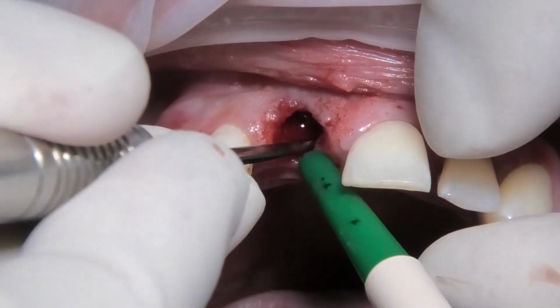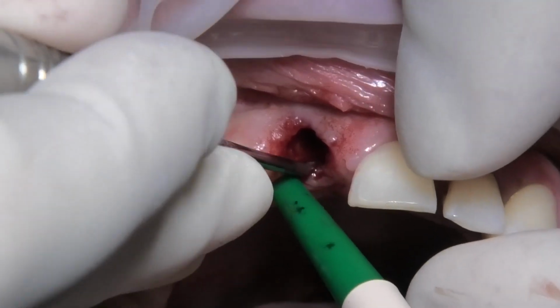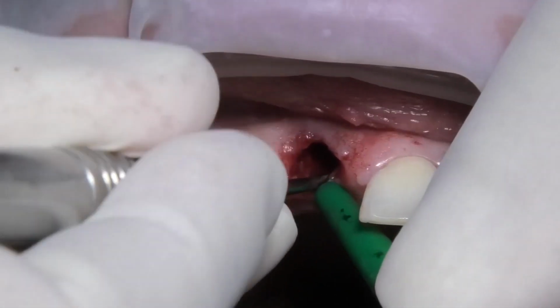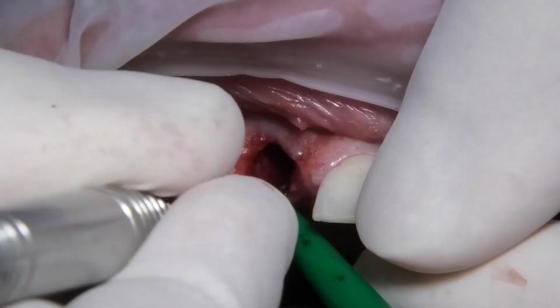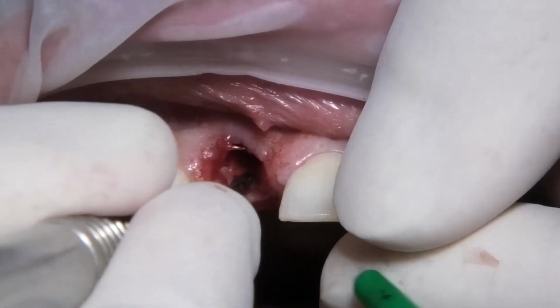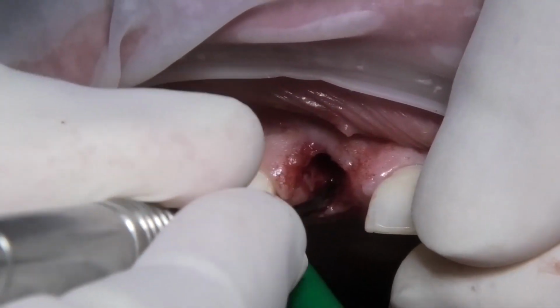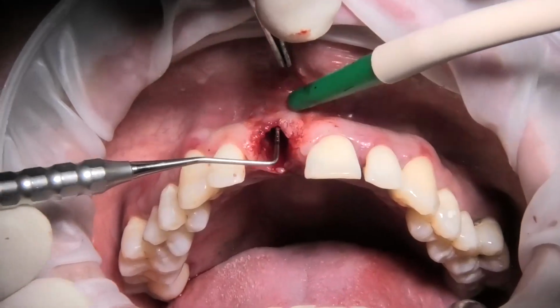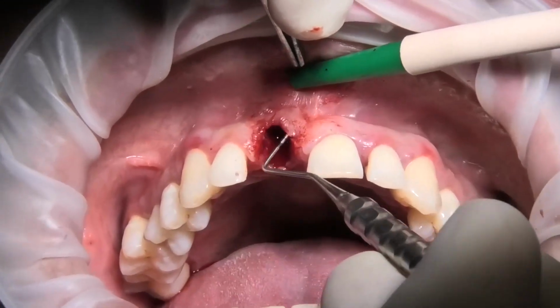Now let's go and check, after this phase, with the periodontal probe, and we check the extension of the vestibular envelope created by feeling the surrounding bone planes. And we go on the vestibular, we go on the palatal area.